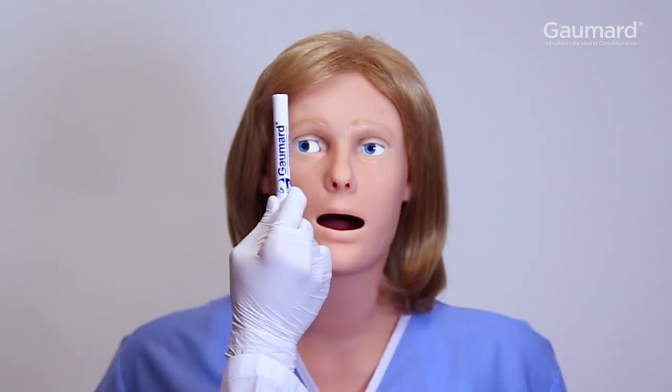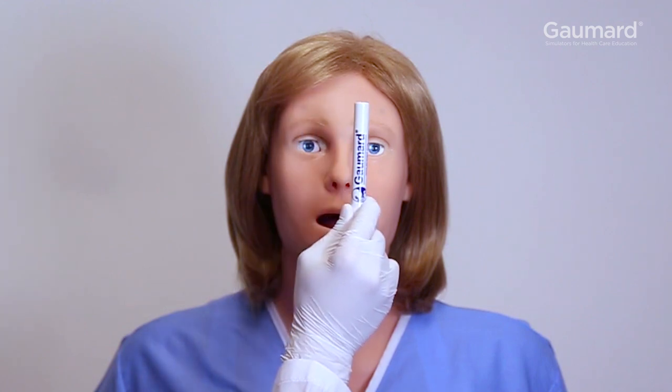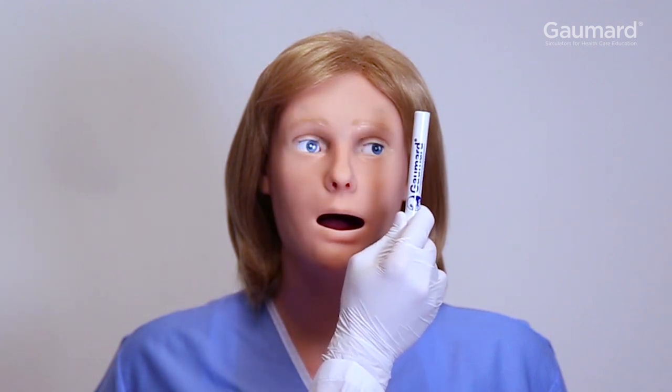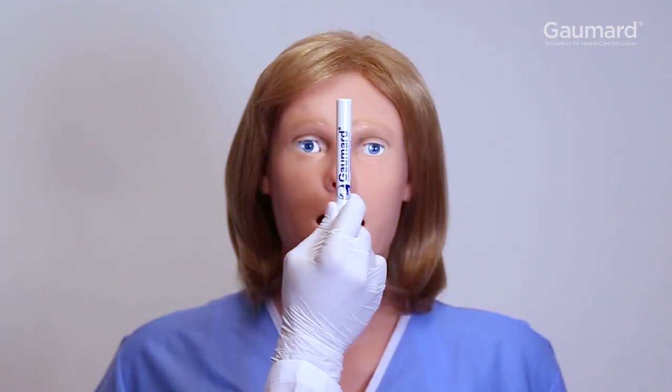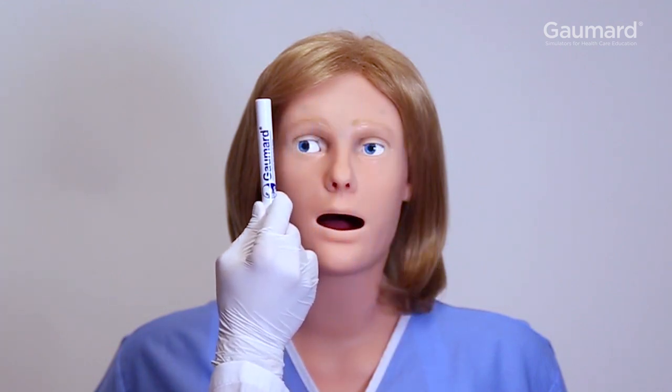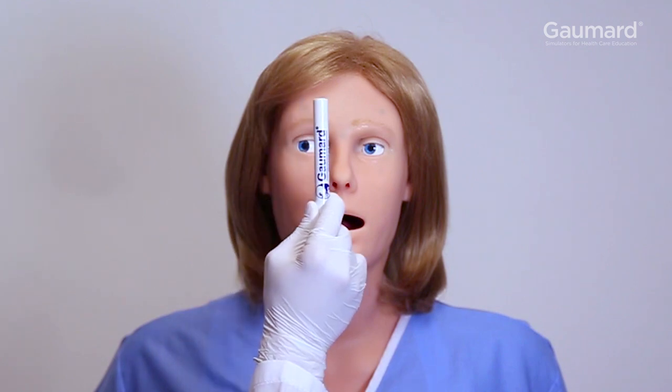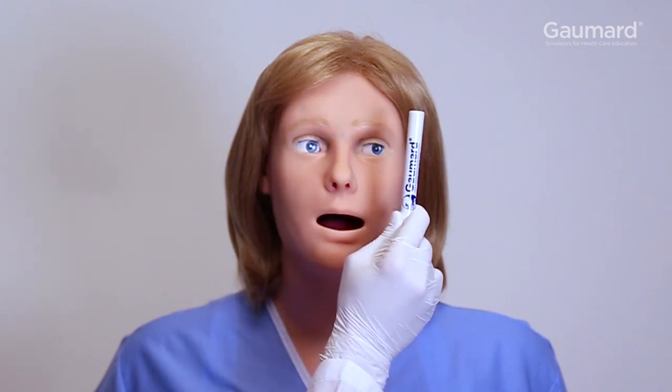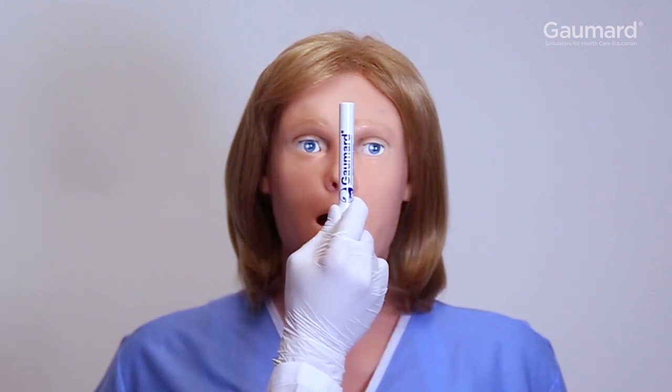When presenting stimuli for the eyes to track, it is best to approach from the front, rather than extending the arm across the side of the face. Note that like in real patients, thicker objects are easier to track than thin ones.